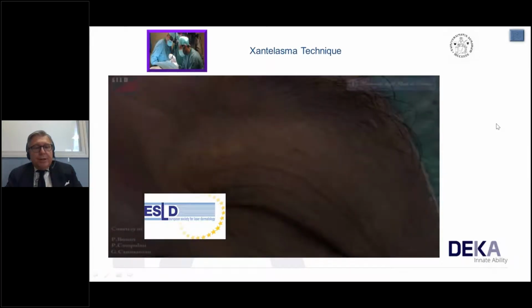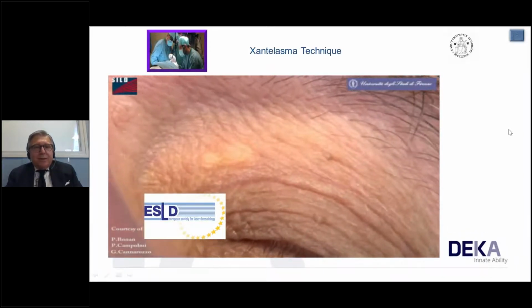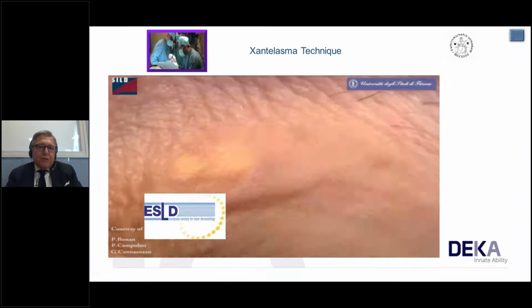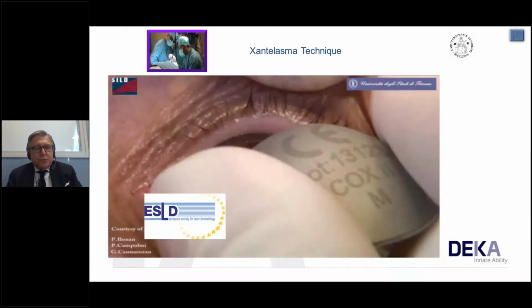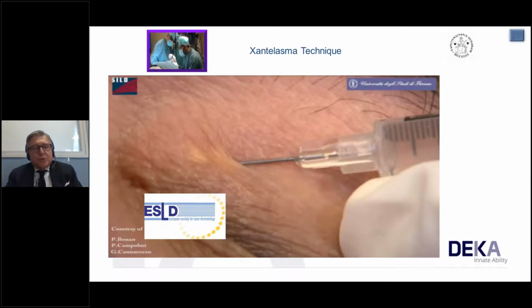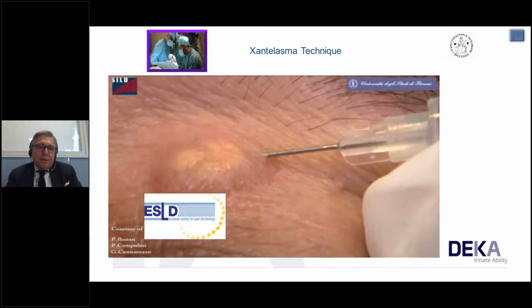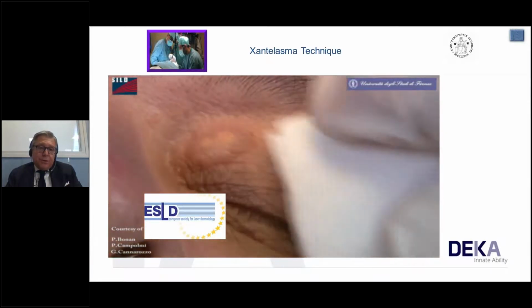Well, we have here another video that is recommended to observe with attention because we can appreciate not only the passes that we use, but also the safety measures, adopting the corneal shields, the metal corneal shields.